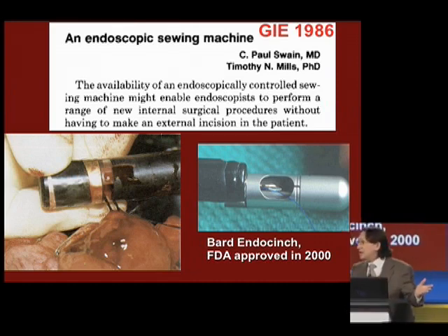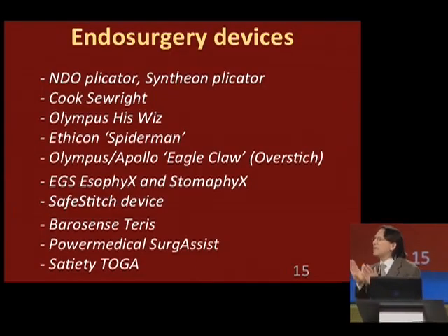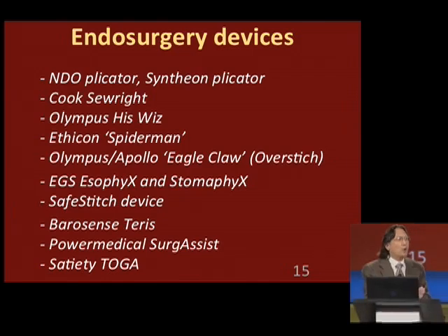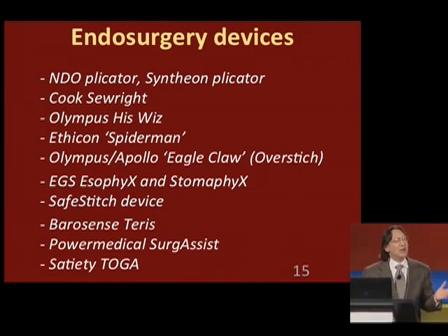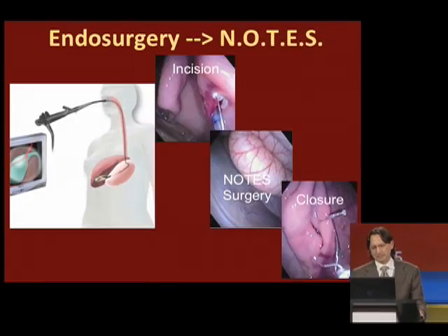Now, it took 15 years for his device to get FDA approved, but it opened the floodgates, literally opened the floodgates for a whole array of new endosurgical devices capable of stitching, and even the bottom two capable of stapling. Surgical tools in our hands.